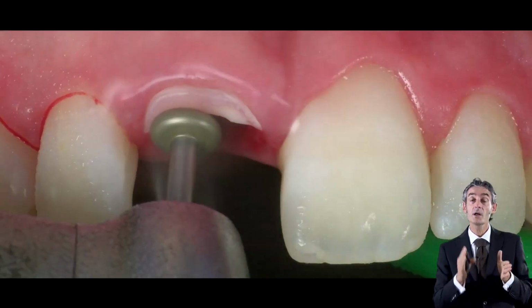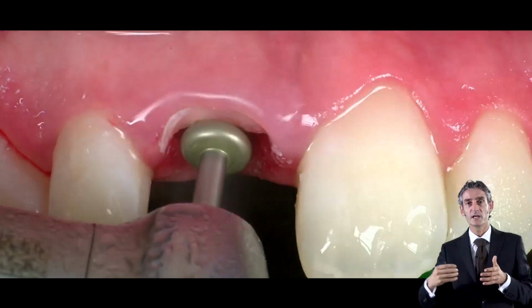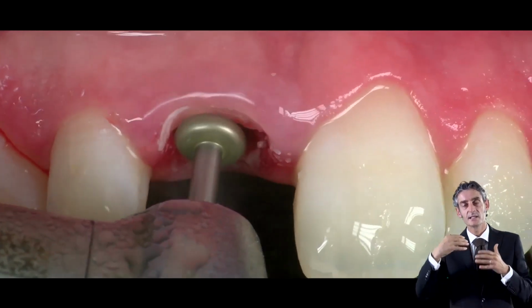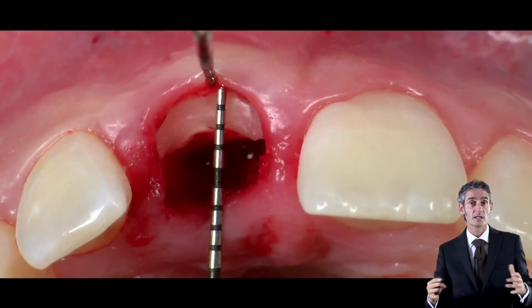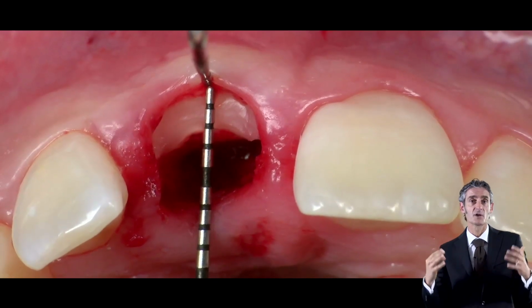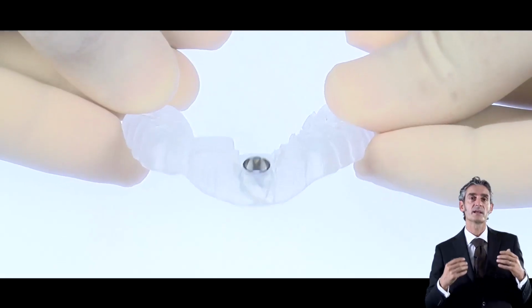That will not be at the bone level, but we have to keep this shield 1 millimeter above, in the way to leave the horizontal fibers inserted in the root as they are, to maintain the anatomy and the scallop design of the tissue. After we decrease the height of our shield, we can start with the guided surgery.